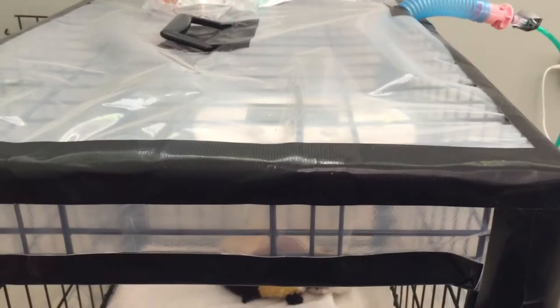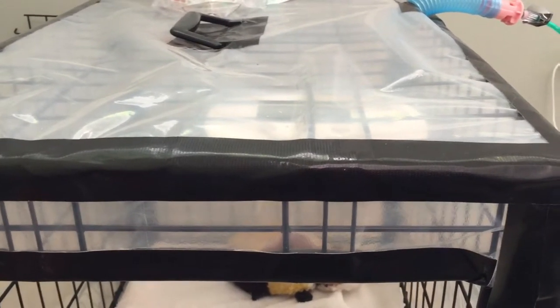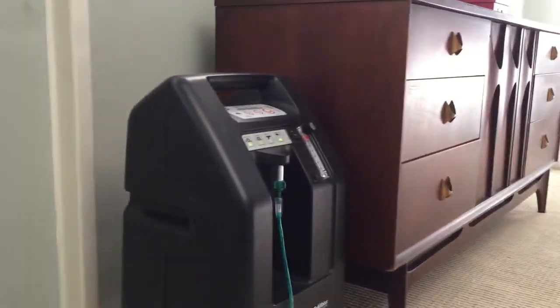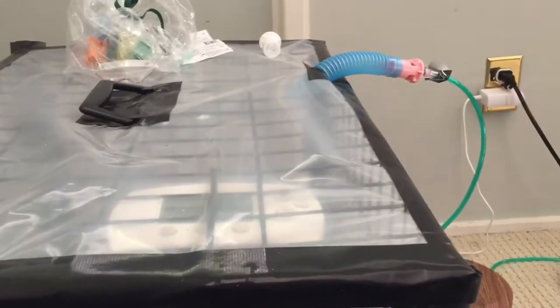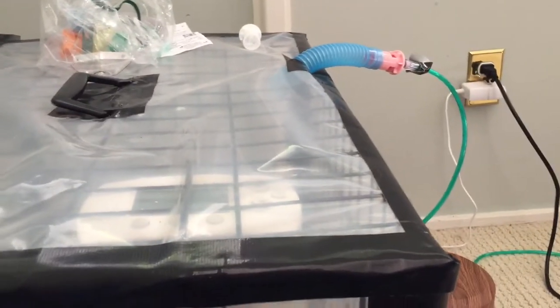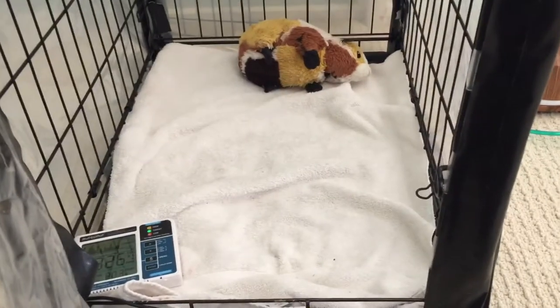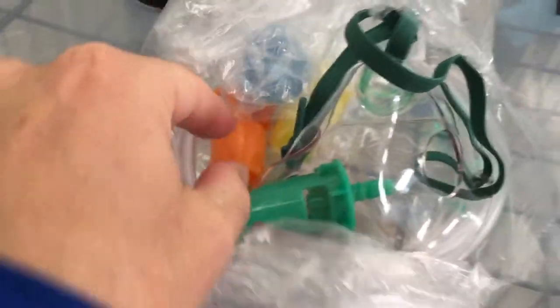Stuffy air indoors is between 1000 and 2000 ppm. Once you get between 2000 and 5000, people start having more symptoms of too much carbon dioxide, so I try to keep it below 2000. Initially I ran the oxygen tube from my oxygen concentrator directly into the crate, but even with all oxygen flowing, the flow rate was not high enough to push out the carbon dioxide — even with the vent open. I was quickly getting numbers over 2000, so I stopped that method. For about eight dollars I went online and bought a face mask Venturi kit.